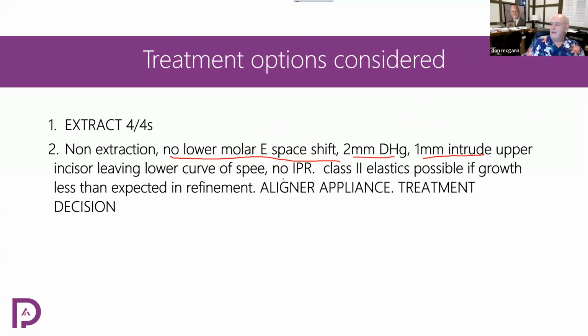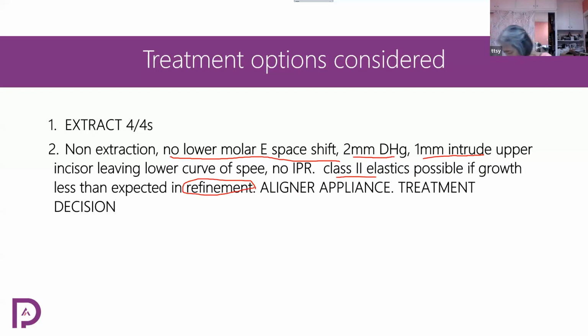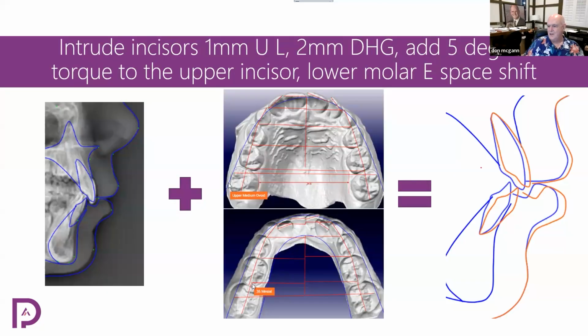By the way, in these mixed dentition cases, we don't do IPR, and we're not likely going to be doing very much class 2 elastic. That'll be on a case-by-case basis. The reason is I'm going to reserve those for phase 2. Okay? So class 2 elastics possible if growth less than expected in refinement. In other words, at the next series of trays, we'll think about class 2 elastics, but not the first one. Added growth, and this is where we get if we just straighten the teeth.